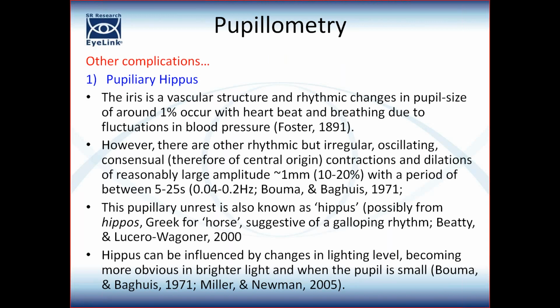The implications in terms of experimental design are that you need to take baseline pupil measures regularly so that you can report some change. And that baseline itself probably needs to be some sort of average over a reasonably long period of time, because otherwise you're just randomly sampling somewhere within this continually changing signal.